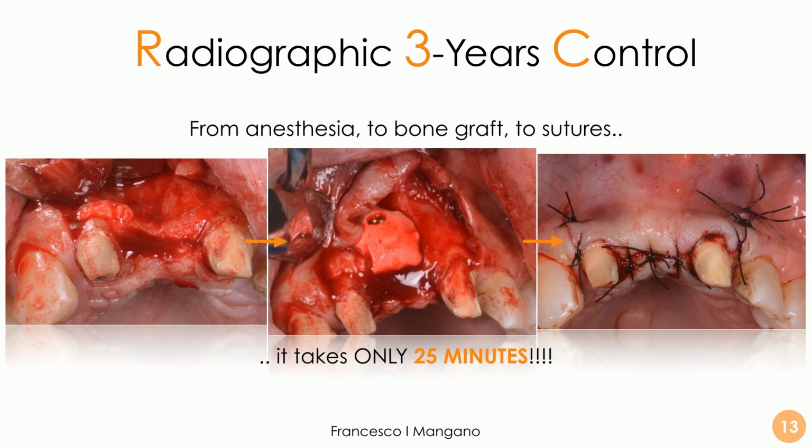The scaffold is full of blood. There's a huge intimate contact between the surface of the scaffold and the residual bone. That is perfect. And also the whole workflow lets us avoid wasting time trying to adapt the scaffold and handling the scaffold that can be contaminated. So there's a risk of infection with the conventional analog procedure. With this digital procedure, we can really be fast, effective, and extremely satisfied after all from the surgical point of view, and the patient is also satisfied because the surgery doesn't take too long, and it's the best way to proceed.